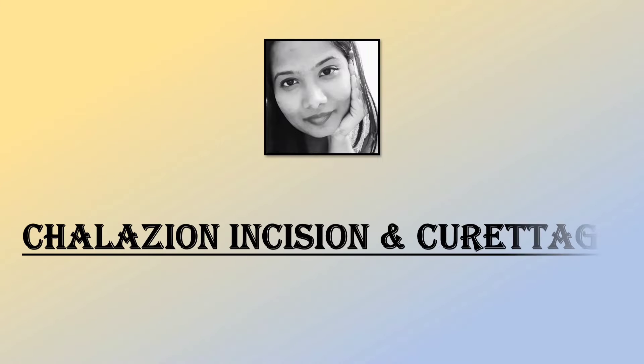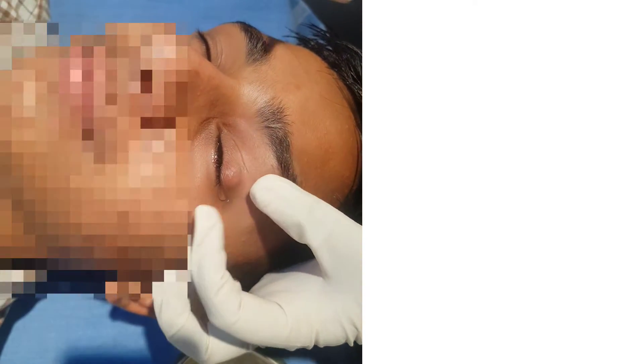Hi everyone, I am Dr. Babita and in this video I will demonstrate how to do chalazion removal. The procedure of chalazion removal is known as chalazion incision and curettage, which is a very simple and a very routinely done procedure in ophthalmology.